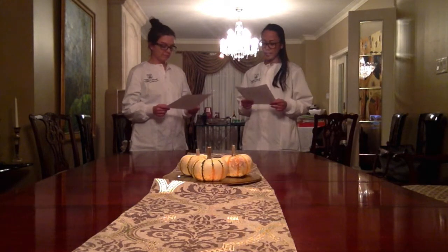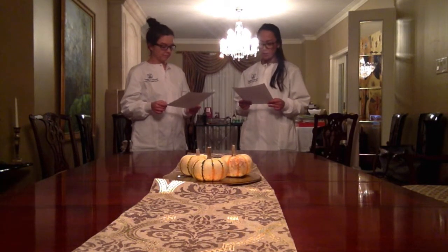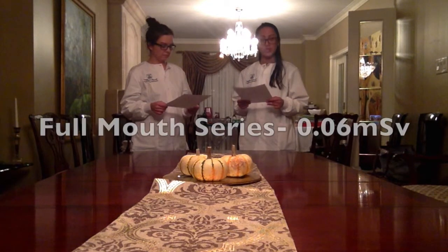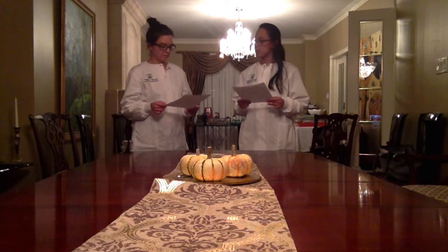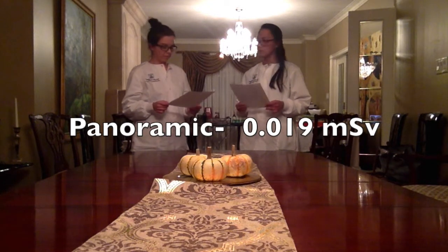Another concern is that the chances of the client getting exposed to more radiation is greater if intraoral radiography is used for complete assessment because it will require taking a full mouth series of radiographs, exposing the patient to 0.06 millisievert as compared to taking one panoramic radiograph, exposing the patient to only 0.019 millisievert.